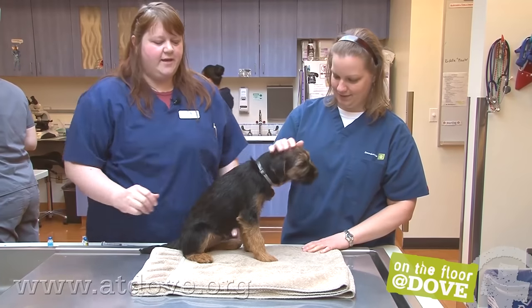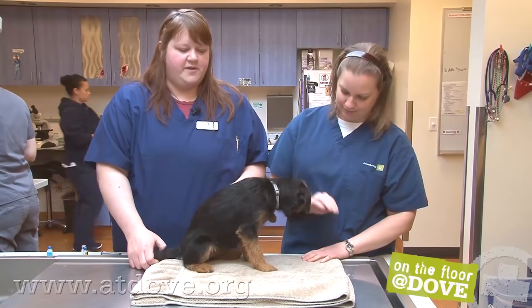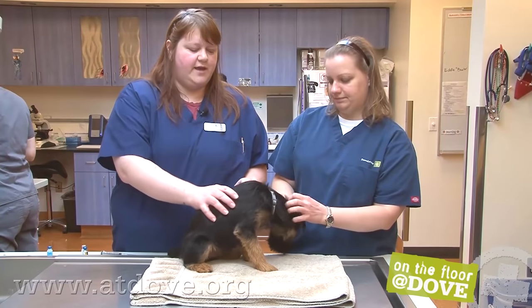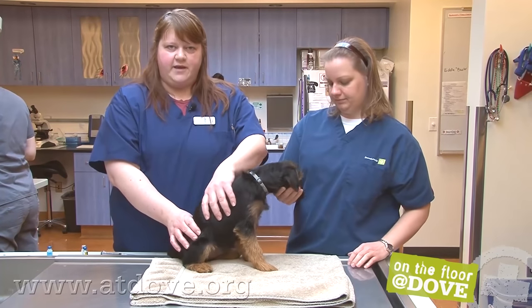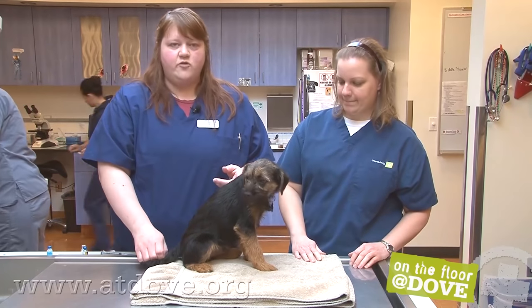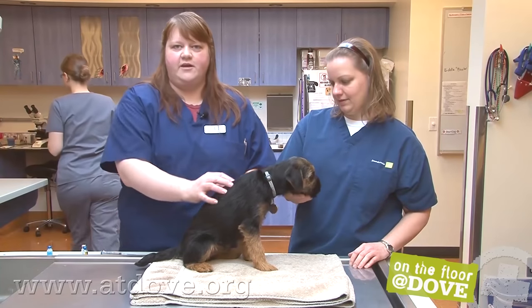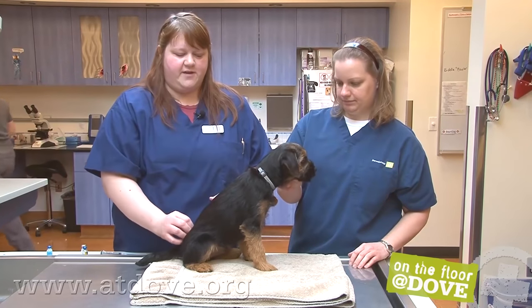So this is Hilo, and he belongs to one of our receptionists here. He's in the middle of his puppy series, so he is due for his third DAP — his distemper parvo adenovirus vaccine — and his Bordetella. We'll give those two together, and then he'll come back in three weeks and get his rabies.